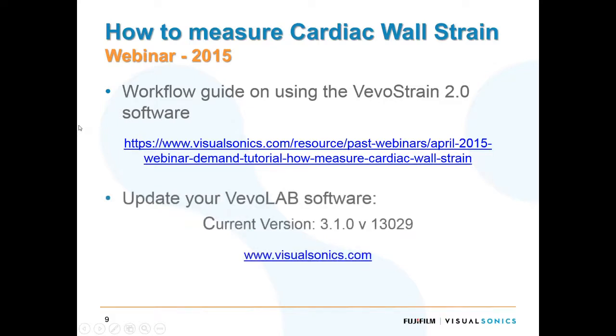I also want to make sure that you have your Vevo Lab software up to date. All of the work that I'll be talking about is using VevoStrain 2.0. And so the current version that's on our website is version 3.1.0. So just go to our website. We always keep that updated with the current version and make sure that you've got that strain 2.0 on your software.